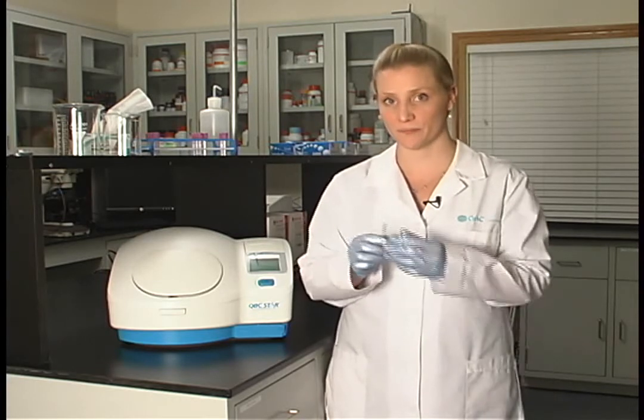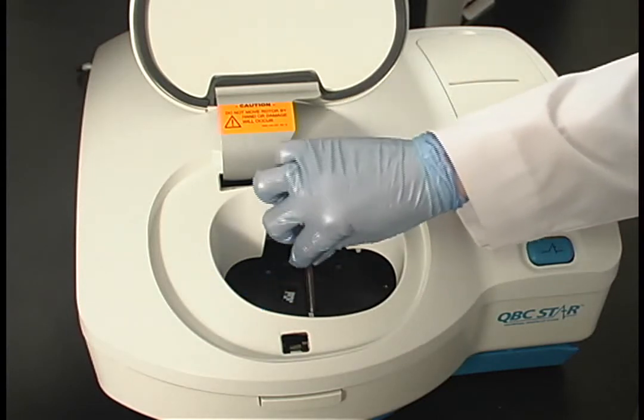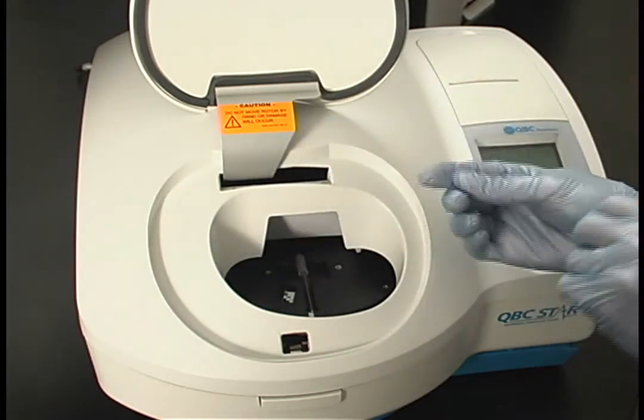Once you've capped your star tube, you're now ready to process the sample. Open the door to the star unit and place your sample in the star. Insert the bottom of the tube — the end with the stopper — into the instrument first, and then rest the sample so that the cap is pointed toward the back of the unit. Be sure the tube remains seated against the rotor to prevent shifting during centrifugation.